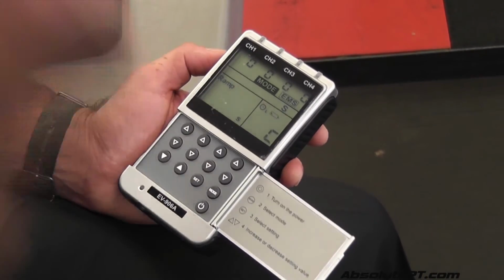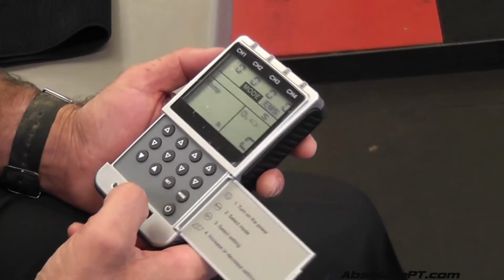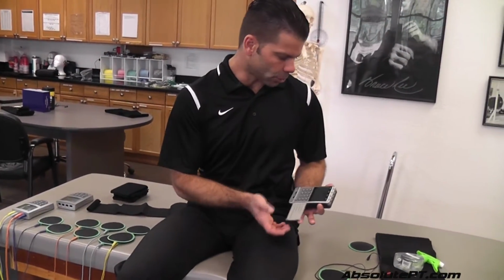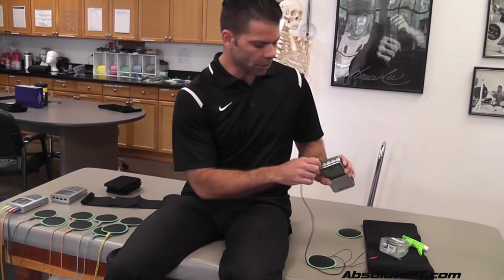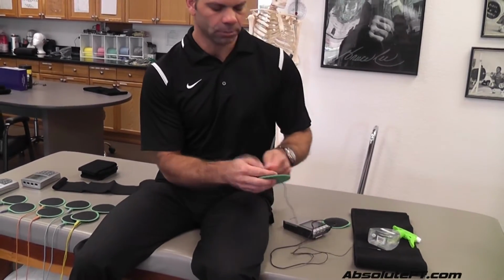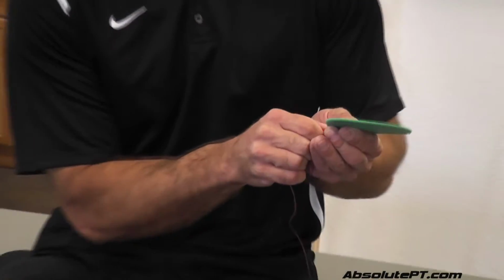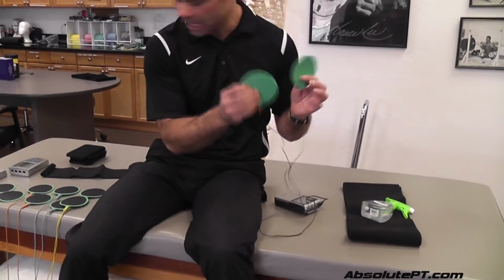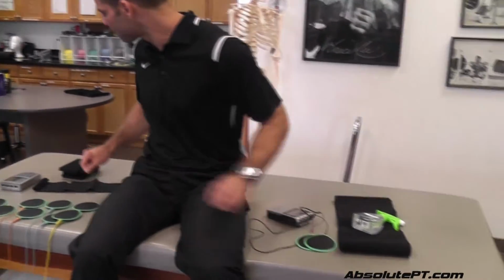And that's it. And so now when I'm trying to set someone up with this, if I'm going to use this, I plug my wire into the channel I'm going to use. I'm going to use just one for demonstration. Plug my wires deeply into my favorite go-to pads. There's a blog on why I like these pads the best. Sometimes I use other pads, but 95% of the time at least I use those.